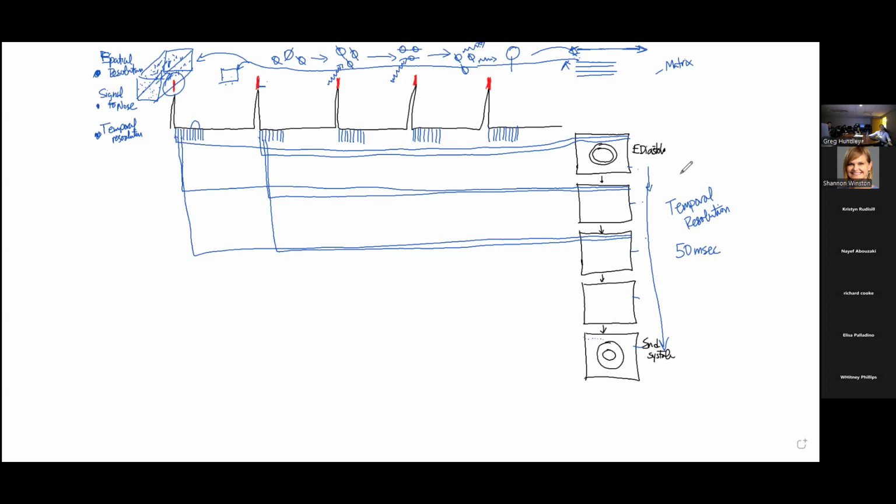So when we were talking last week about the images, remember, we had our field of view, and then we were talking about our matrix. So I'm going to put my matrix, let's go down here. We had our field of view, and then we had our matrix. And does anybody remember the matrix sizes that we were talking about, the number of lines?